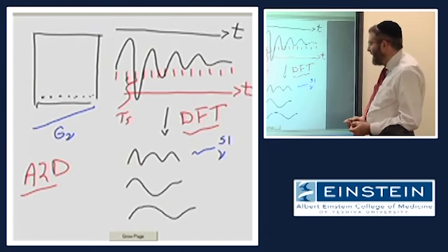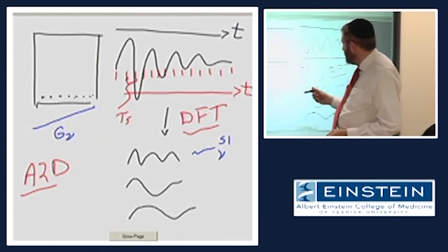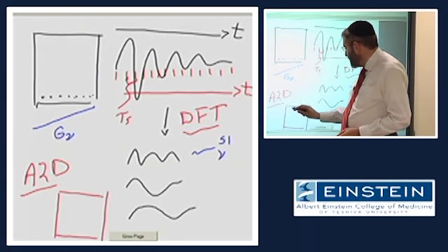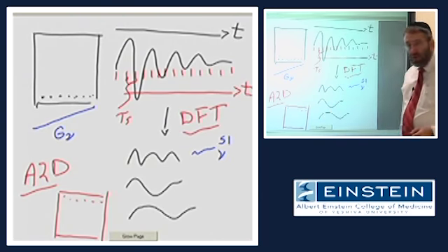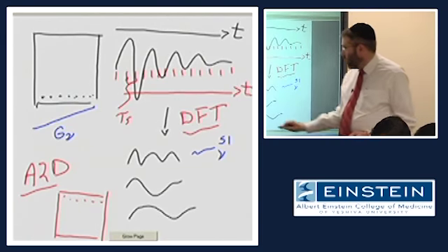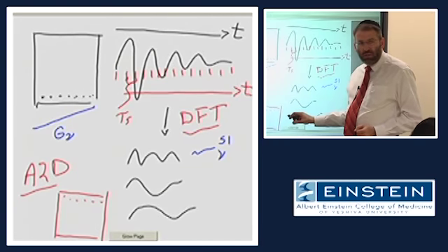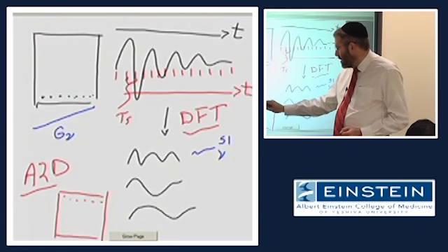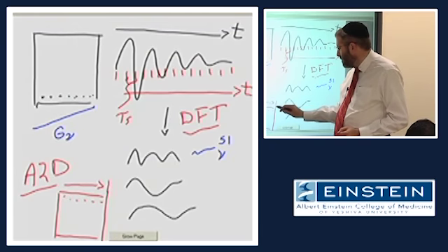So what we get out of this, and we can then go and record this basically in a spreadsheet, is a series of numbers, each one of which is a measure of signal amplitude. And we can write those numbers down in the order that we collected them over time.